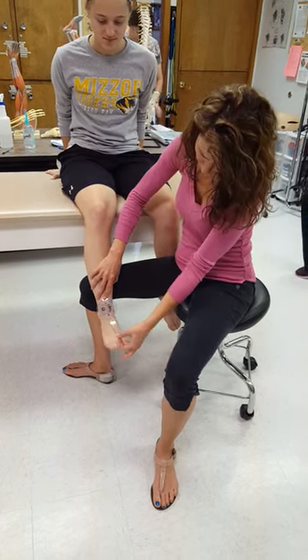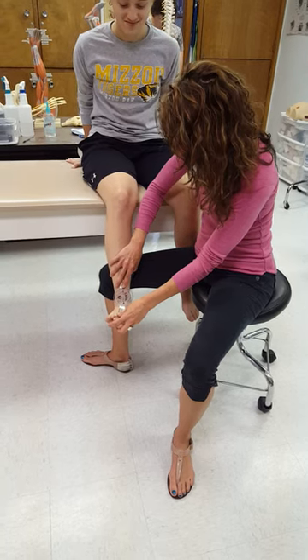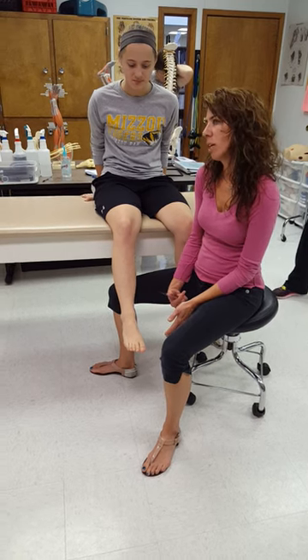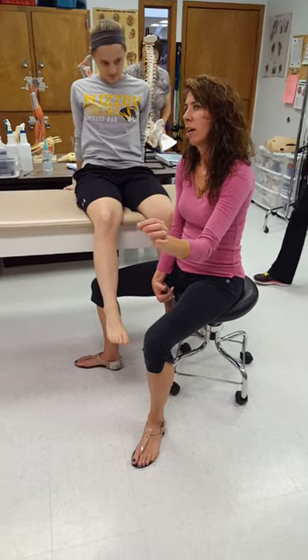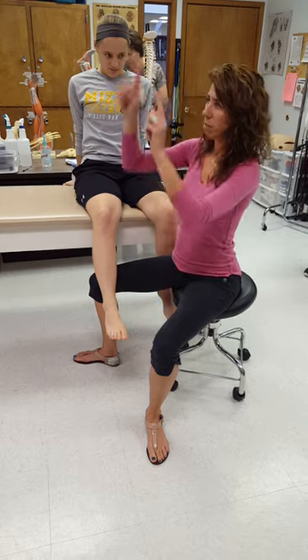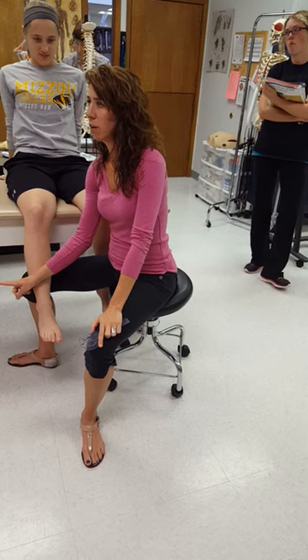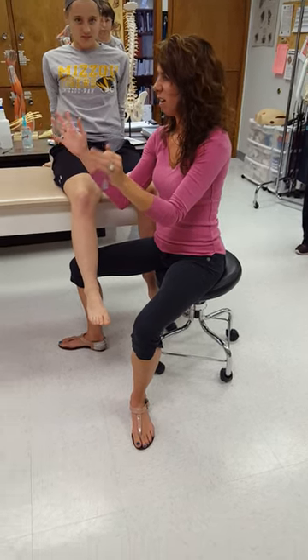Bring her back to neutral and try again. She's got 10 degrees of eversion, which is probably why she was trying to compensate — normal is 15 degrees. A lot of times you'll see joints with hypermobility on one end of a plane also have hypomobility on the other end. She's a perfect example — five degrees extra going into inversion and lacking five degrees going into eversion, but her total range of motion is still within normal. Sometimes you see that and you don't worry about it as much.